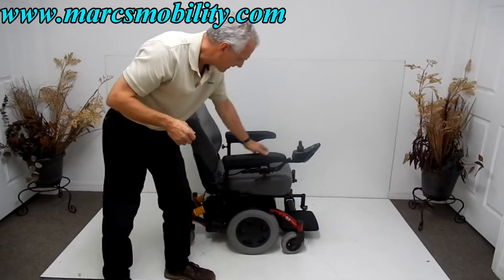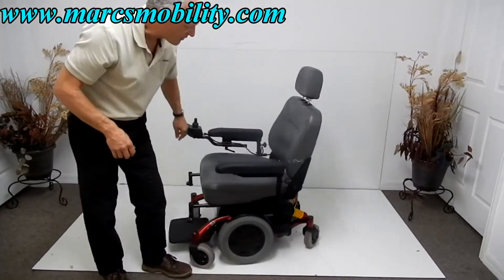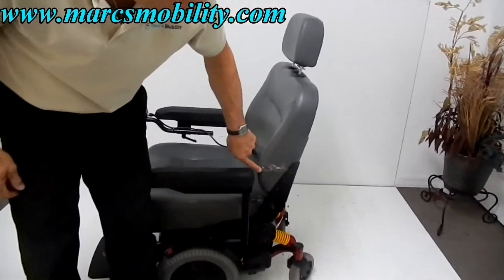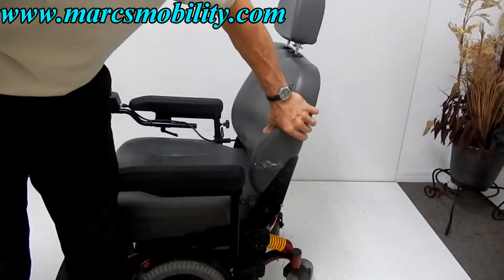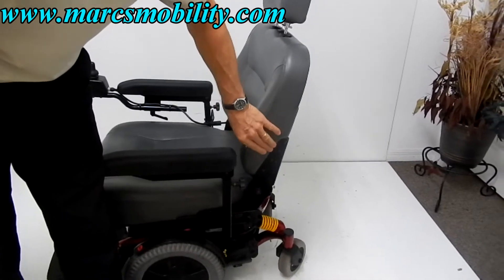The only thing with this power chair is the gentleman who had this chair put the arm too close to the seat on this side, so there is a gash on the side, which will not affect the seat at all. I'm not going to get that fixed because it would be too expensive for what I have in the chair.